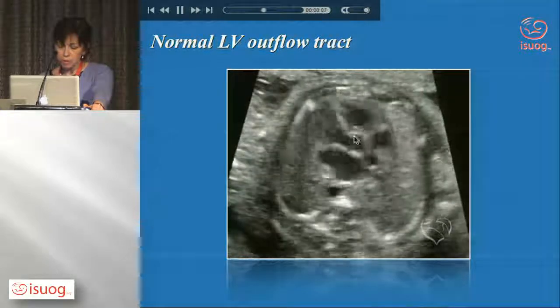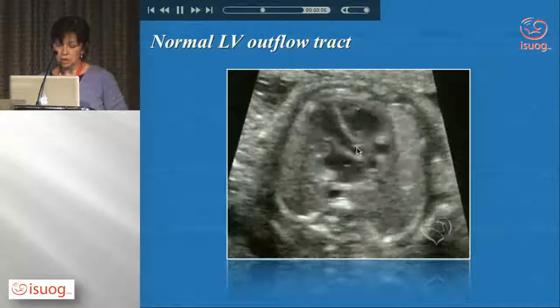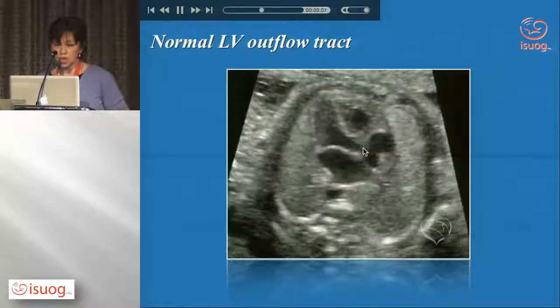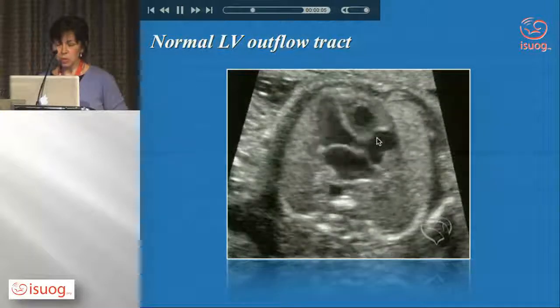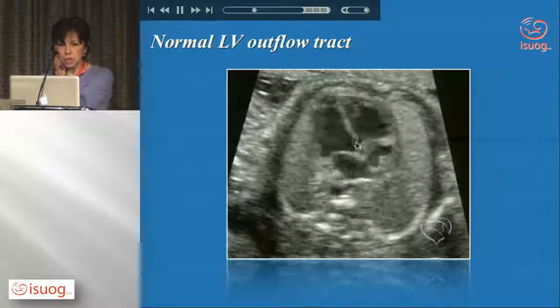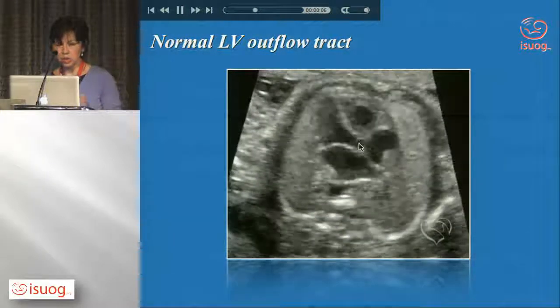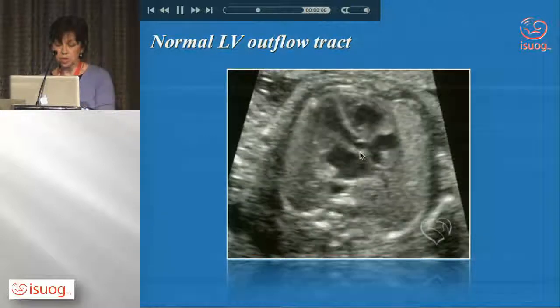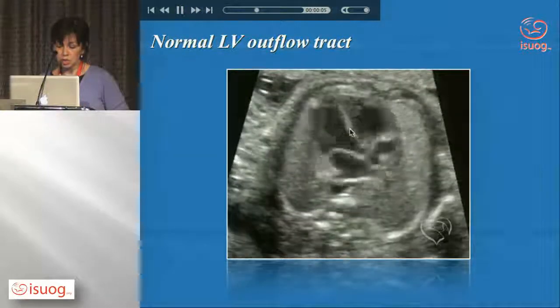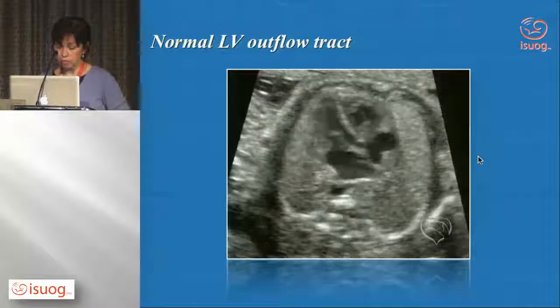In this apical view, we can see that this clip is very, very short because the aorta is just starting to come, like the five-chamber view. It is wedged between the mitral and tricuspid valves, and you only need to tilt your transducer very, very gently to get that outflow tract. If you do it too quickly, you may miss a ventricular septal defect in this area, which can be foreshortened. So it's important to do it slowly, and if the baby's moving a lot and you're not sure, stop and review your clips so you can adequately see the continuity between the interventricular septum and the anterior wall of the aorta, or the vessel arising from the left ventricle.